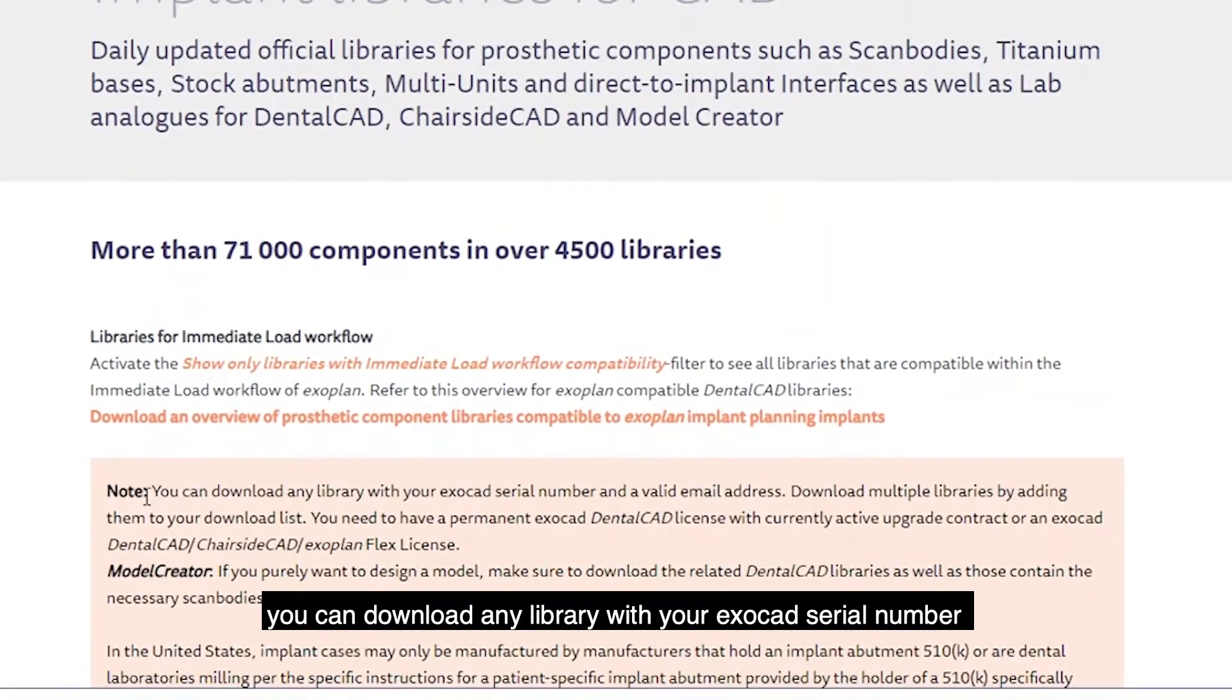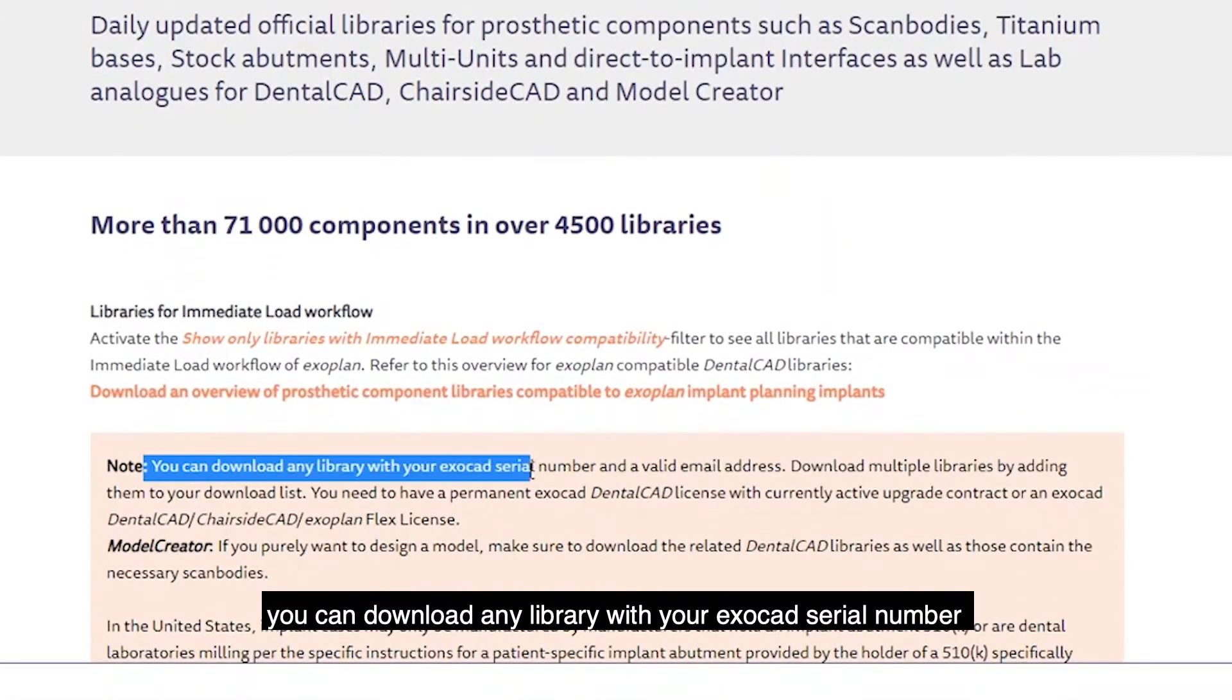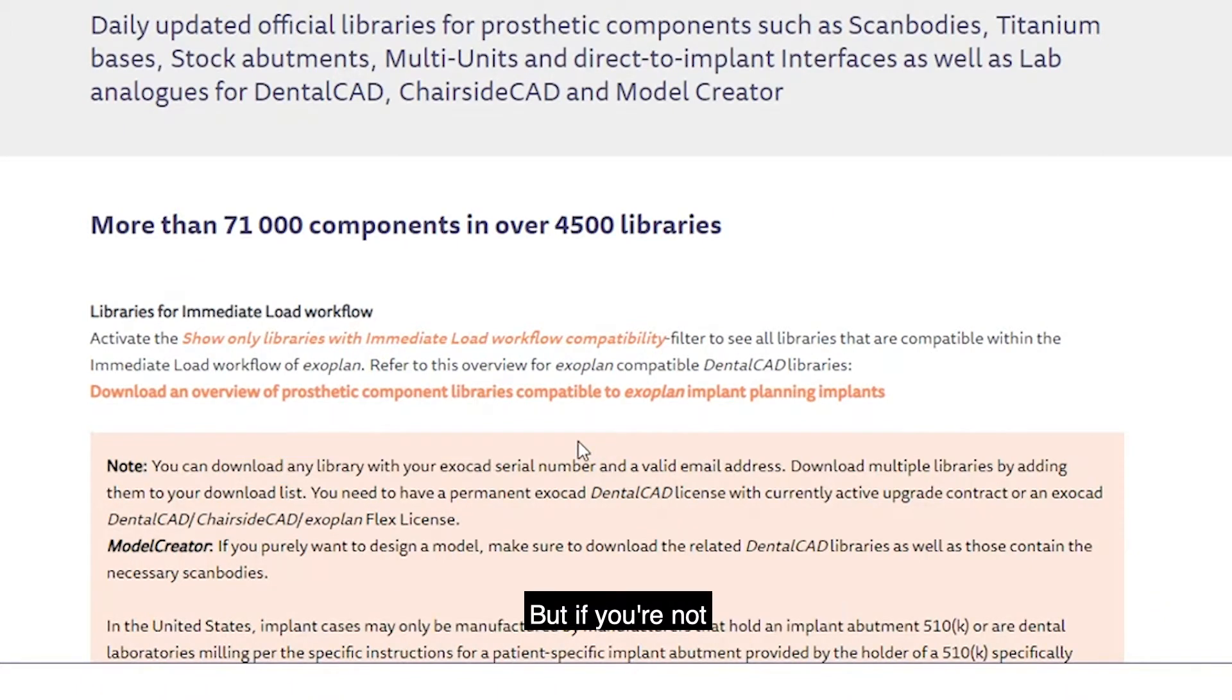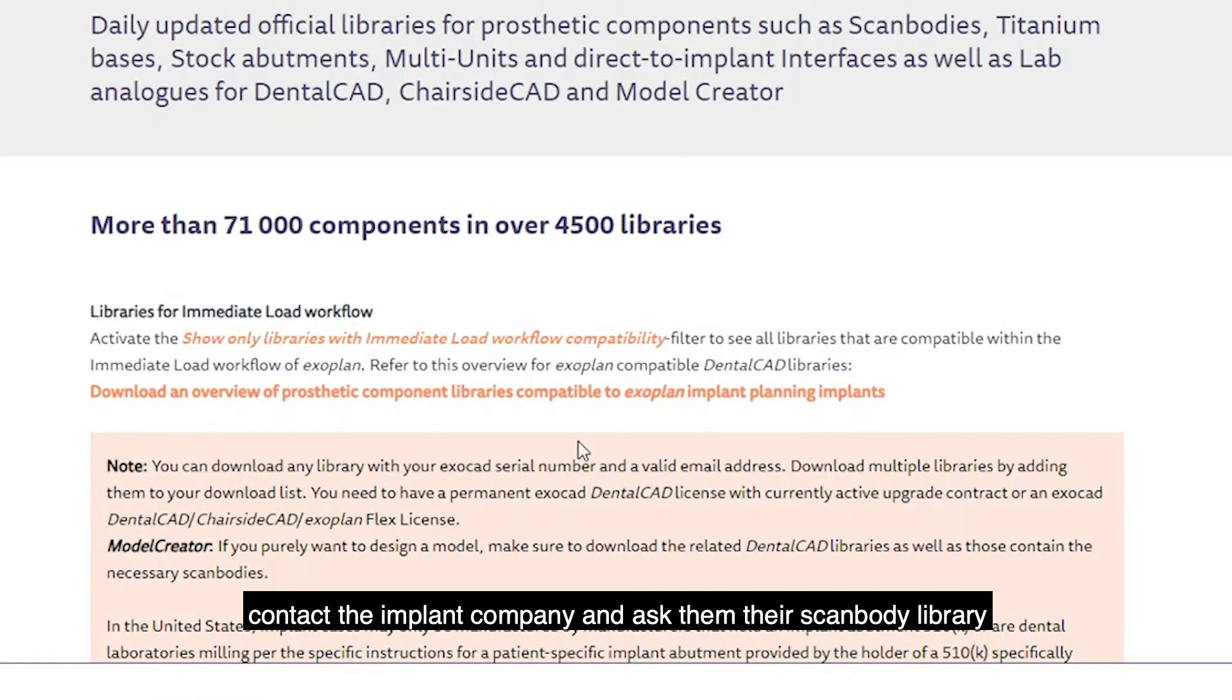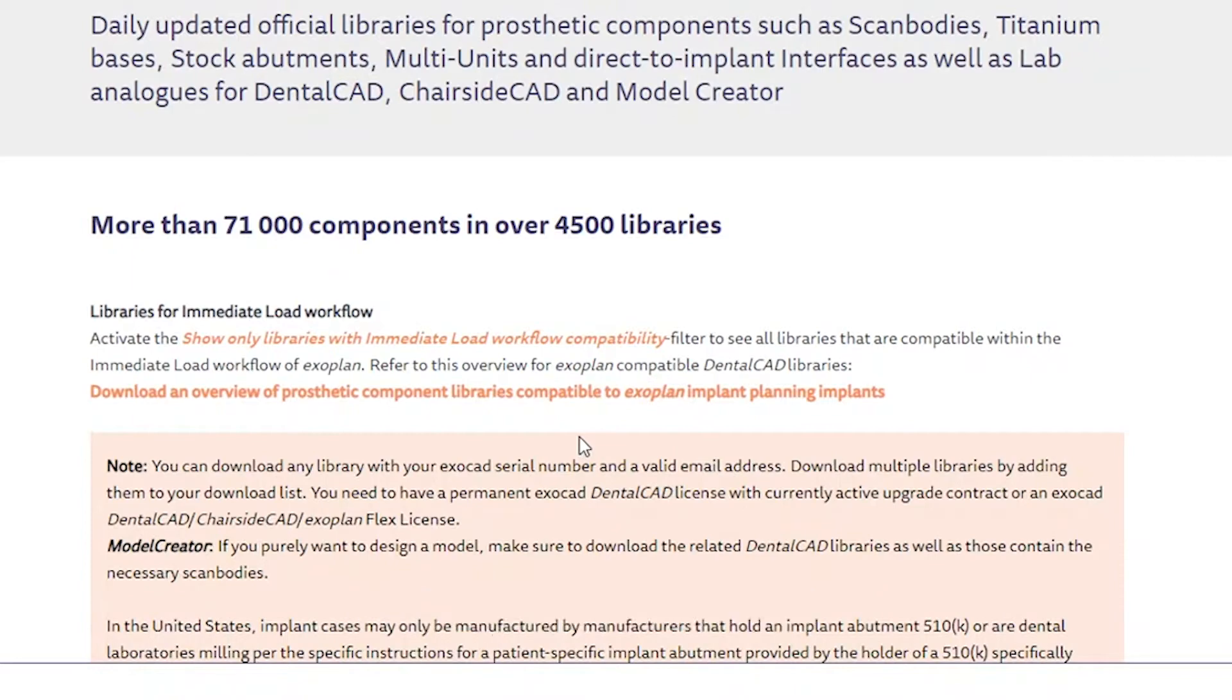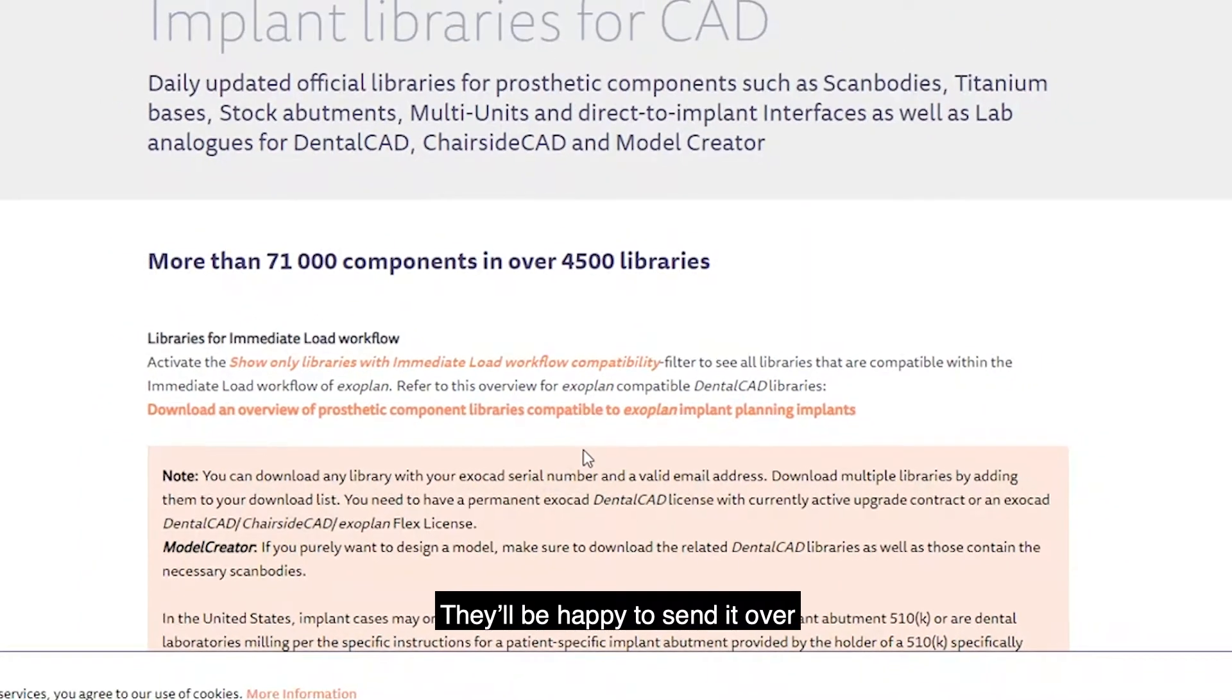You can download any libraries with your ExoCAD serial number. That means you need to have a dongle. But if you don't have one, contact the implant company and ask for their ScanBody library, the size and design that you want. They will be happy to send it over.